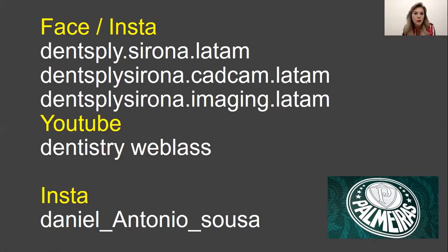Other question, do you mix the cortisone with the anesthetic? So it means that I give the anesthesia in the area in which I have to prepare the teeth. And at the end, after 2 hours, during which I prepare, take the impression, and do again the mock-up, before sending the patient home, I give an injection in the local areas of 4 milligrams of cortisone, because it helps to stop any bleeding the day after when you have to cement the restoration. And overall, the swelling.